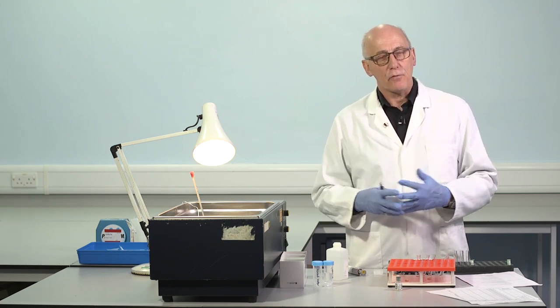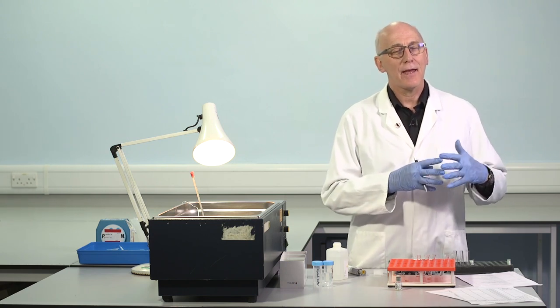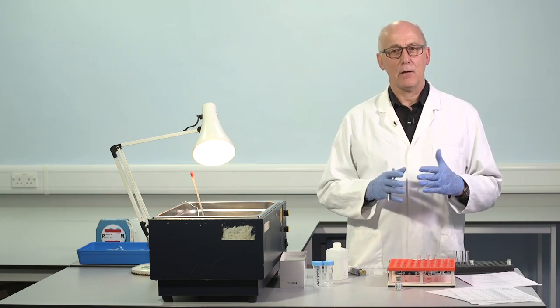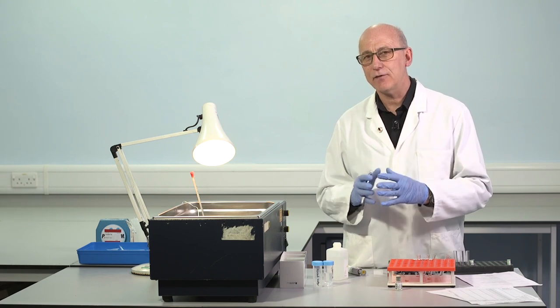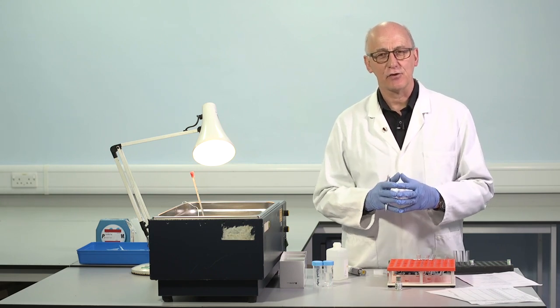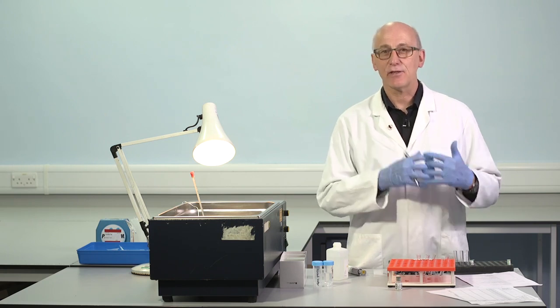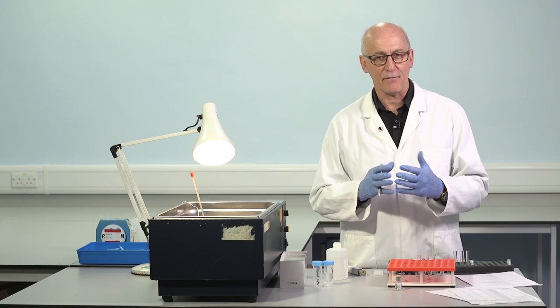But what's been shown by careful study is that the assay is fully quantitative provided the residual factor VIII at the end of the 2-hour incubation is somewhere close to 50% of its starting point. And I'm now using the term percent advisedly.